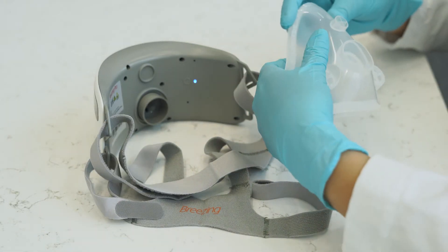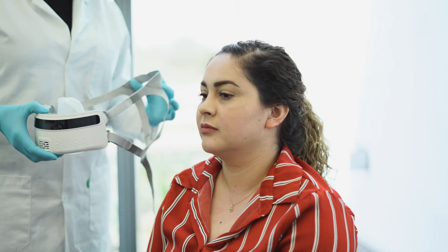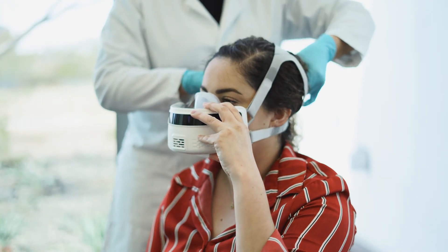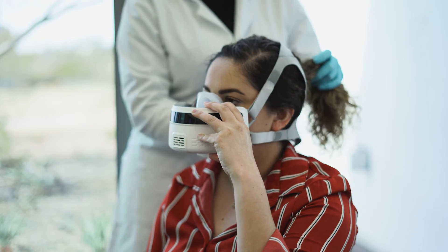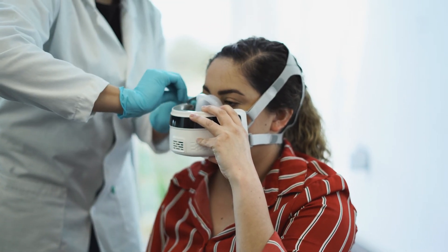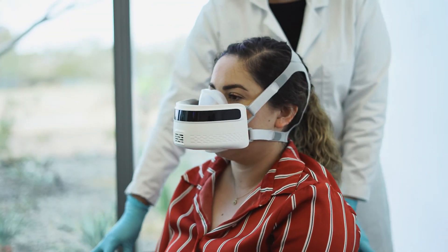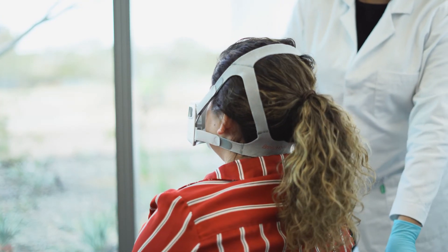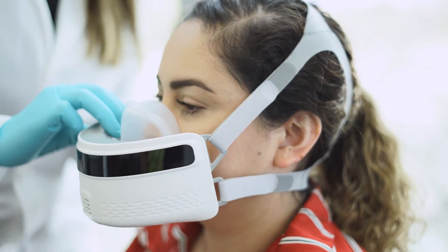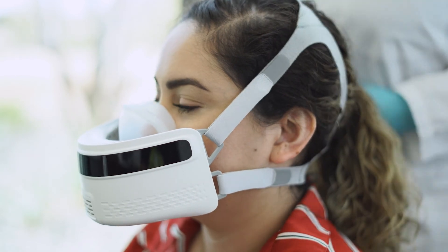Step eight: Place on Patient. After the device is self-checked, attach the silicone mask to the Breezing device. With the strap attached by three anchoring points as explained earlier, place the Breezing device on the patient's face, asking the patient to help hold the mask over the nose and mouth, and grab the remaining loose strap. Pass the straps over the head and tighten them symmetrically. Make sure to tighten all straps enough to avoid leaks so that the disposable mask is completely flush with the patient's face. For patients with long hair, you may want to tie up the hair to ensure a better fit. Ask the patient if he or she perceives leaks — streams of air passing through the edge of the mask — and readjust the mask position as needed.